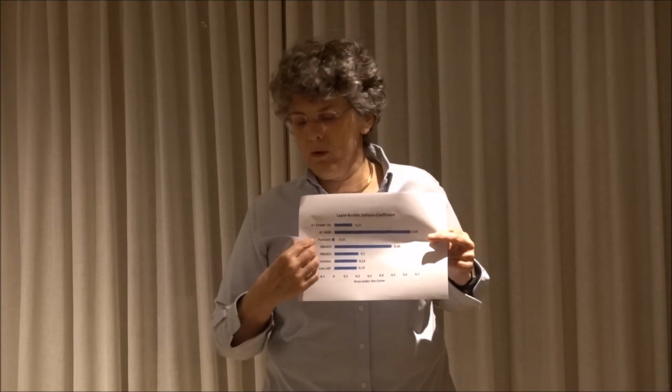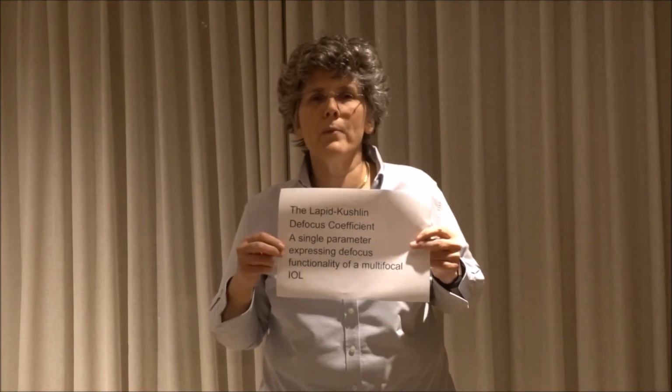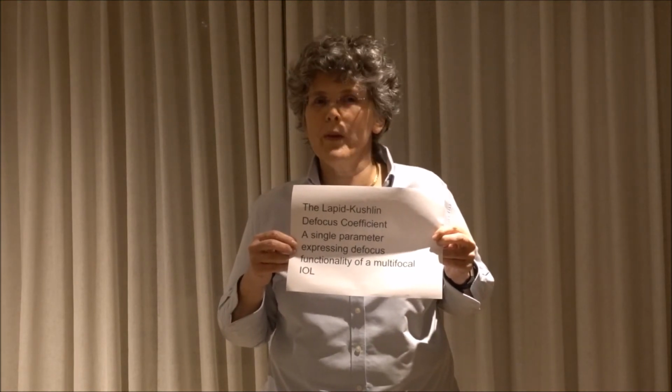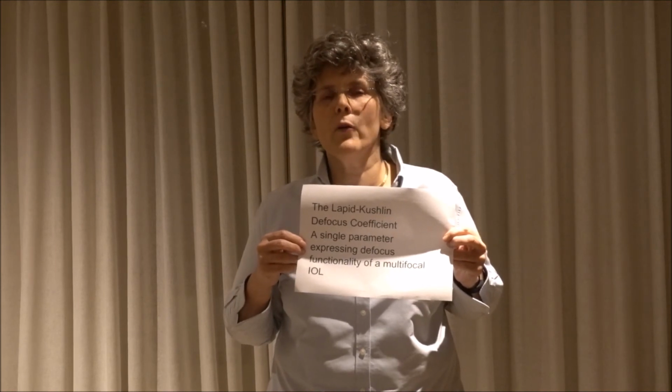In short, what the Lapid-Kushlin defocus coefficient gives us is a single parameter which allows us to grasp within one number how well the defocus functionality of a multifocal IOL is.